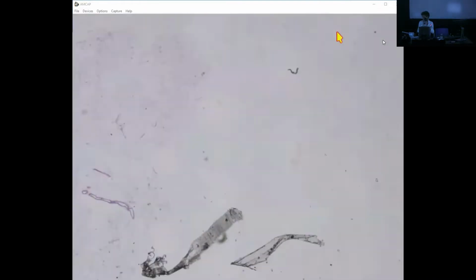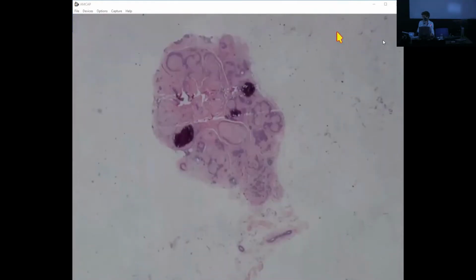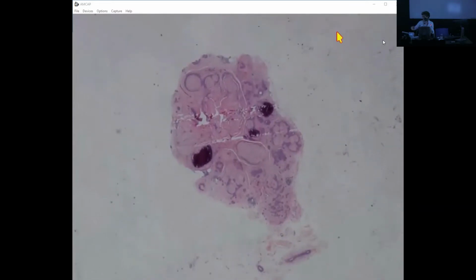I have another case with tubular carcinoma, but I will not show it. Oh, here is an interesting case. So classic, let's see what we have here. Maybe you guys can render the diagnosis. These are not challenging cases. A fibroadenoma done for calcifications. This actually illustrates also the point that Dr. Collins made yesterday about calcification kind of scratching the tissue across.